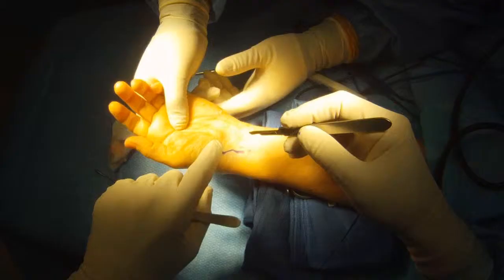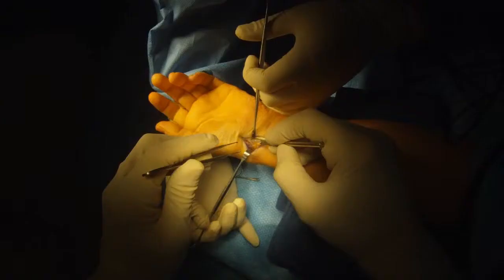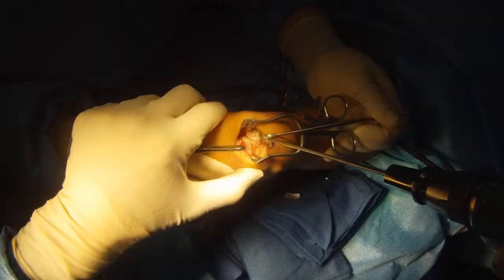I'm drilling a guide wire now from the back of the wrist through the scaphoid to the front of the wrist. I'm going to make a counter incision on the palmar surface of the wrist, dissect the tendons free and get them out of the way, then pass the guide wire from the back to the palmar surface of the wrist.